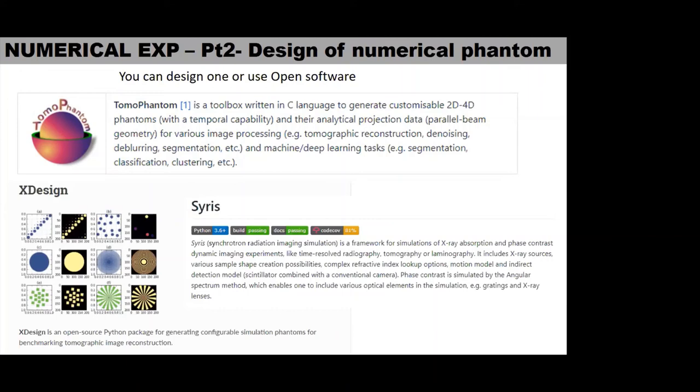And Dr. Madu also mentioned multiple energy CT being the gold standard in future. Well, in my own opinion, I think he made a comment for MRI, where he mentioned that you can take multiple projections in just one shot. And I think if I'm an administrator and I want to purchase a unit, if I think about the cost, I don't see a reason why multiple energy CT would actually outperform normal CT scan units.